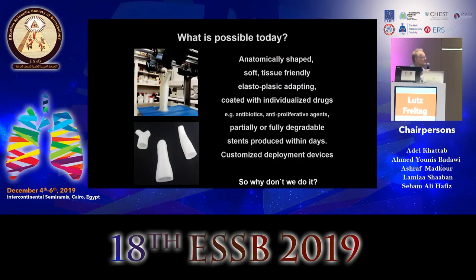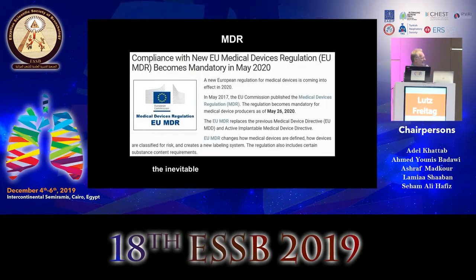So what is possible today? We can have anatomically shaped, soft, tissue-friendly, elastoplastic adapting stents coated with individualized drugs. They can be fully or partially degradable. They can be produced within days. And custom devices can be made. So why don't we do it? Unfortunately, we have regulations. These are the regulations for Europe. And in May 26, they will come into final place.